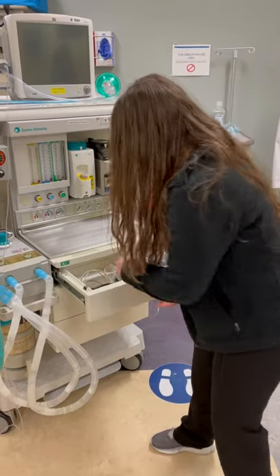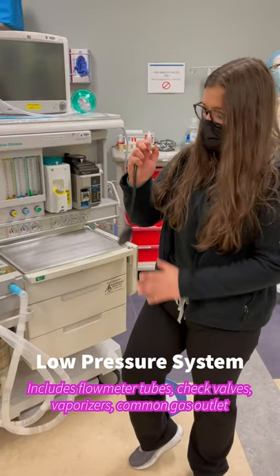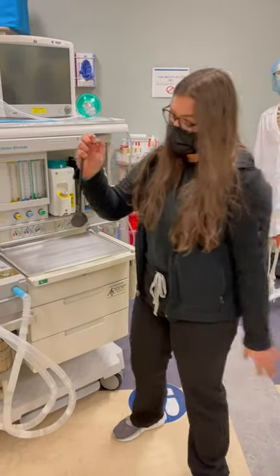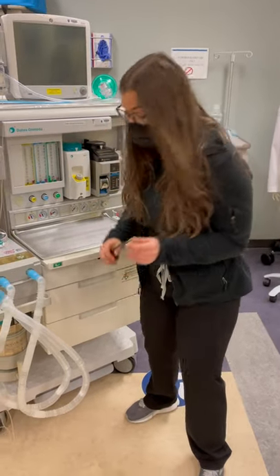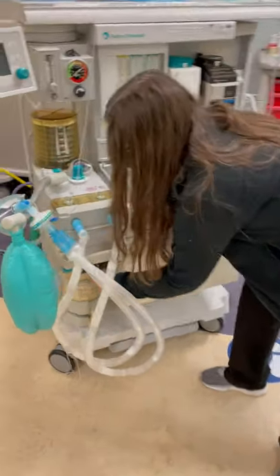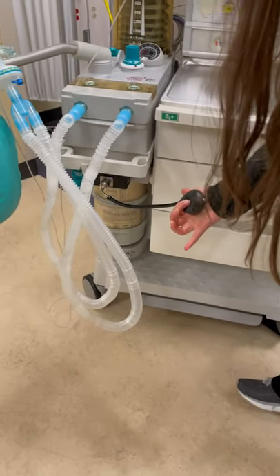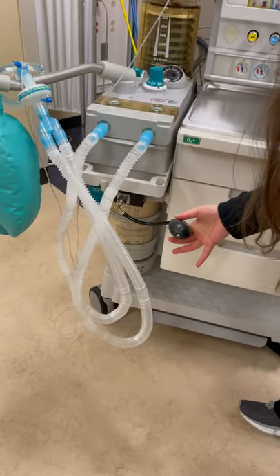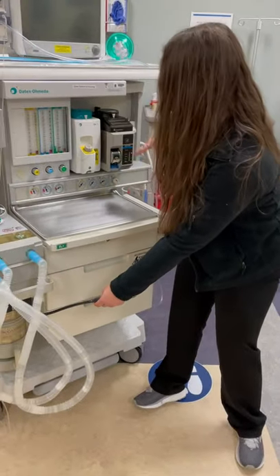I'm going to check for leaks in the low pressure system. I'm going to make sure that I can occlude this bulb — that you would find in the top drawer — for 10 seconds, and make sure there's no leaks in the actual bulb. I'm going to connect to the common gas outlet. I'm checking for leaks in the low pressure system by making sure this bulb stays occluded for 10 seconds.